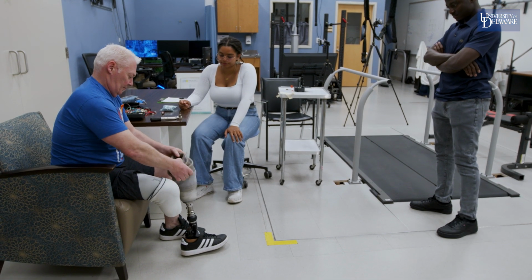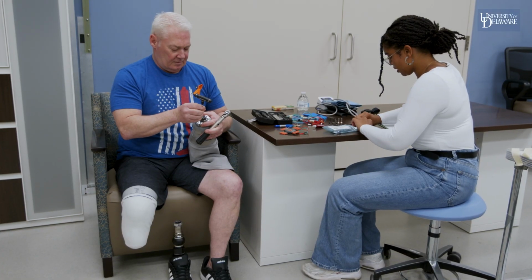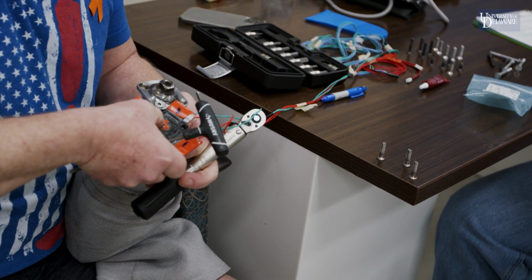We're conducting a study looking at pylon loads, so the amount of force that's being carried in a prosthetic leg. And this is thanks to some support from the Maggie Neumann Health Sciences Research Fund. The goal is to make a device that can help amputees adjust to their prosthetic and really understand how much weight am I putting on it.